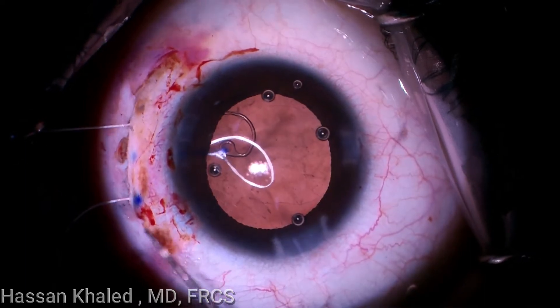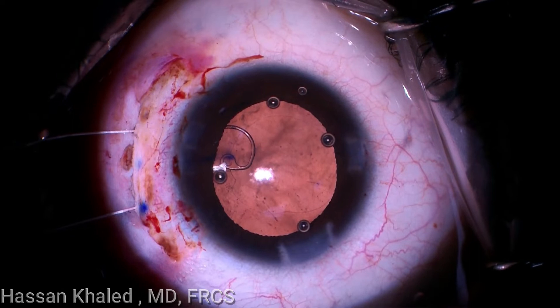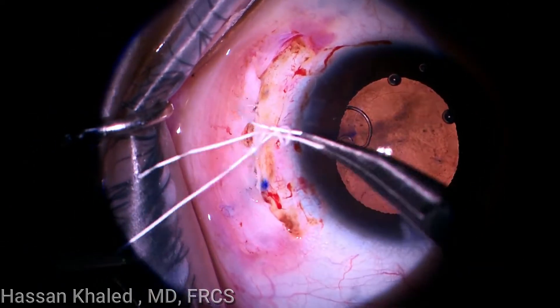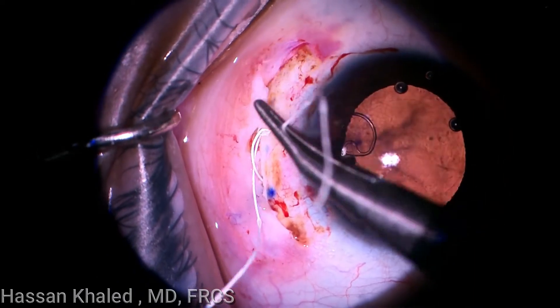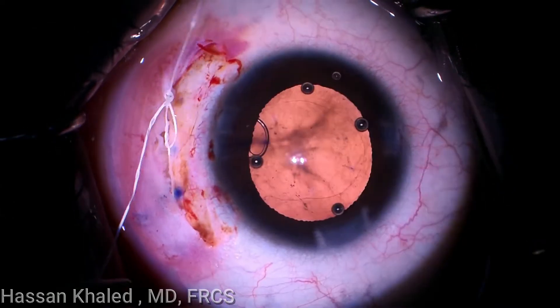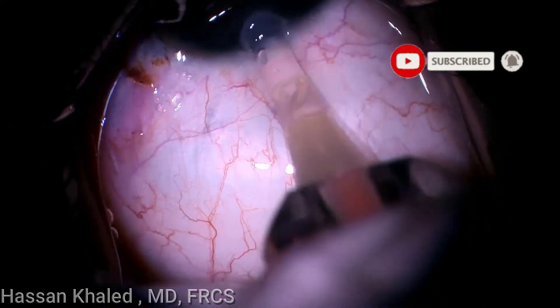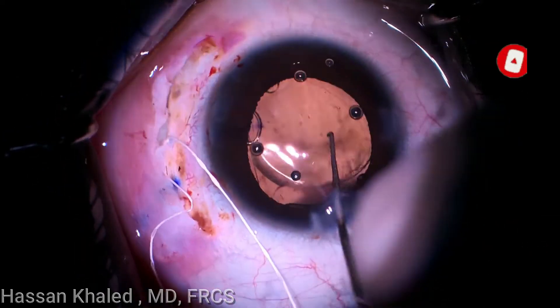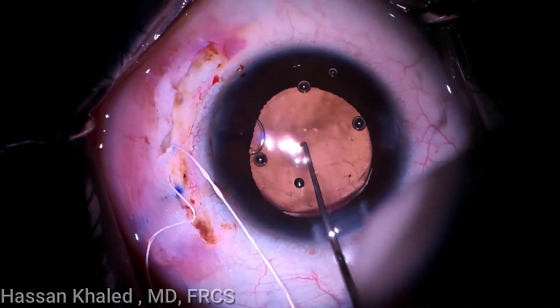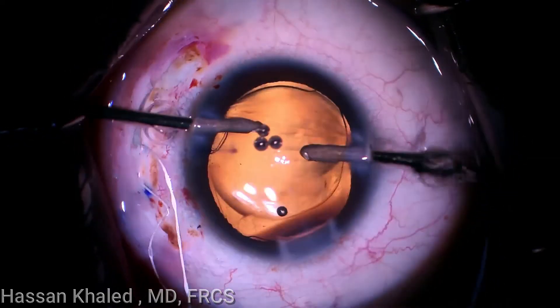Then the Ahmed segment is inserted and implanted inside the capsular bag and adjusted inside it. The viscoelastic OVD is then washed out from anterior and behind the IOL, as you can see.